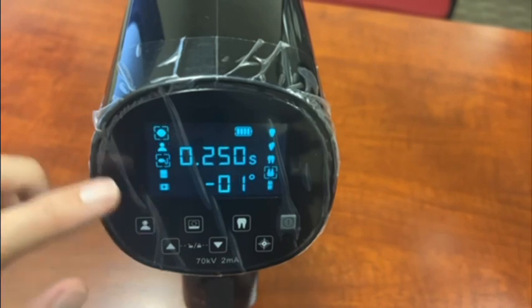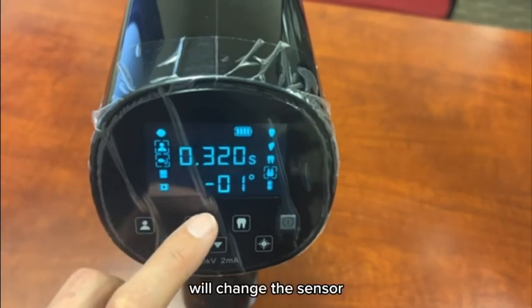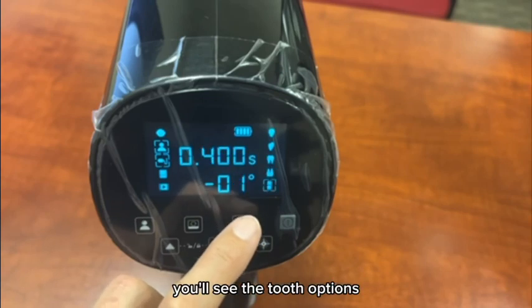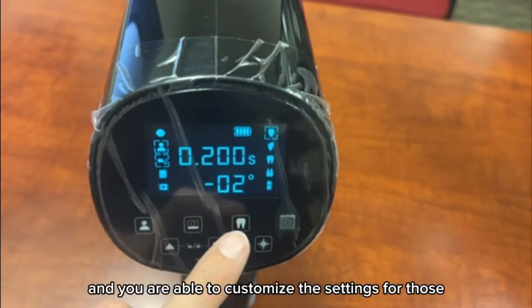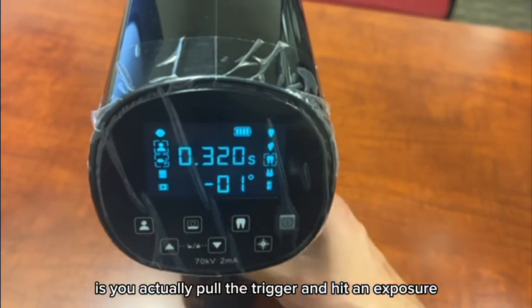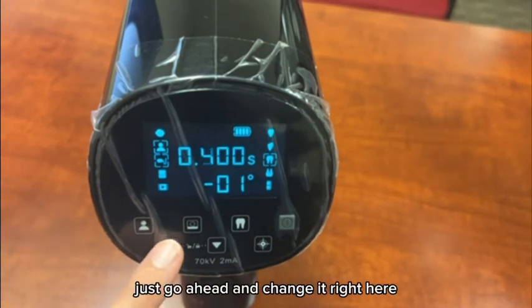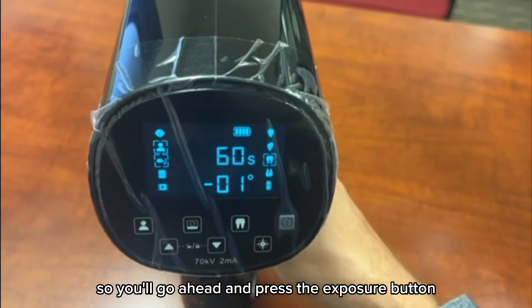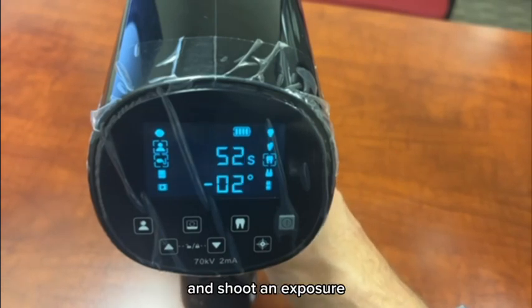When you choose this, you can see how it changes — you have your child and then your adult. This one right here will change between sensor, phosphorus plates, and film. Right here you'll see the tooth options, and as you change these tooth options you can notice that the exposure rate does change. You are able to customize the settings for each section once you figure out what settings you want — you pull the trigger, take an exposure, and it will remember that for next time. To raise or lower the exposure, just change it here up and down.